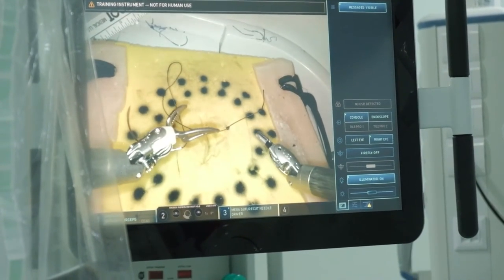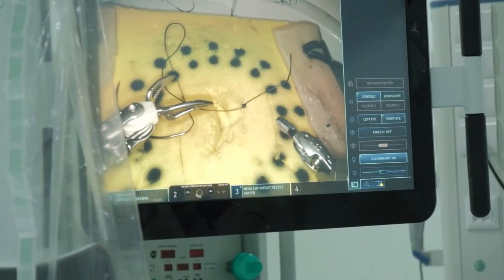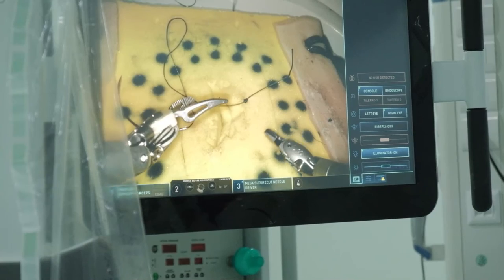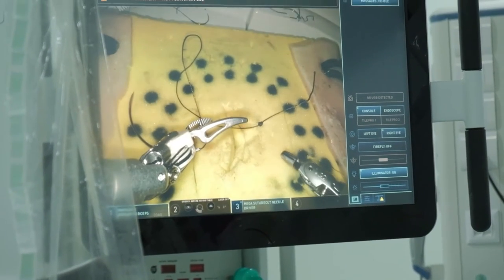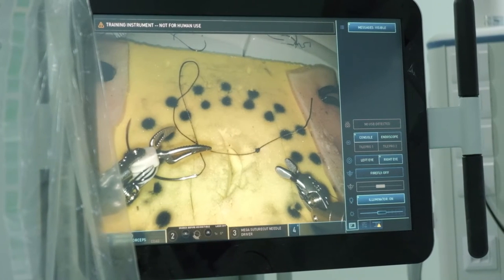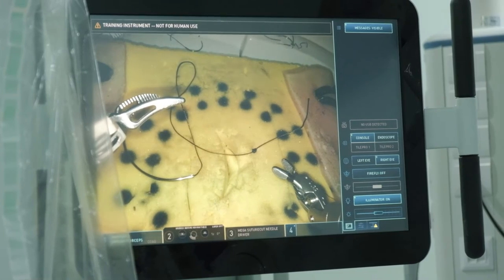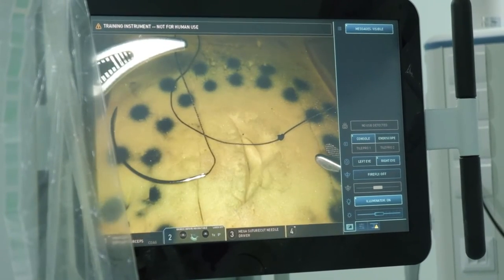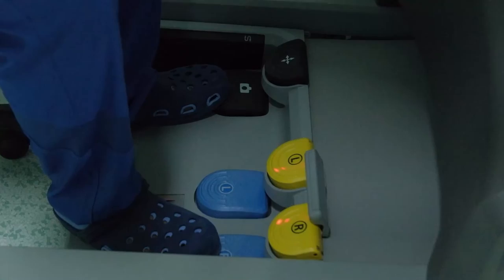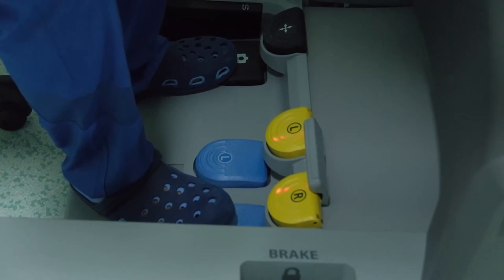Also we have diathermy pedals on my left and right. I can use the diathermy for both the instruments. I can see whether it is a 0 degree or a 30 degree scope. I can do 0 degree up and down. I can swap the instruments if there are more than 2 instruments there, and I can clutch it. So this is like driving a car. This is like how you use your various brake and clutch pedals in order to drive a car. So these foot pedals are being used to control all the four arms.